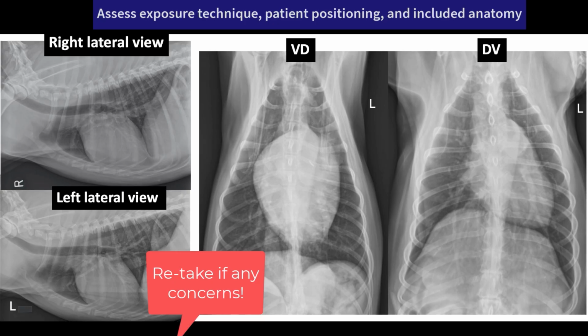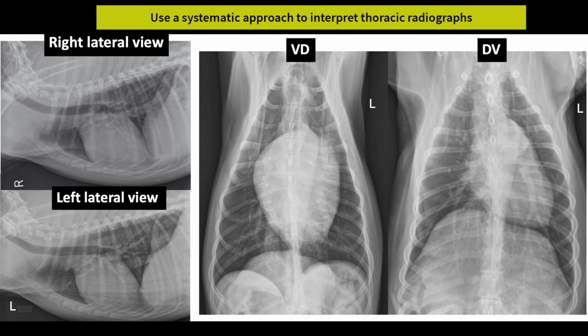This is an example of appropriately exposed and positioned thoracic radiographs. Additional videos and information on evaluation of radiographs for appropriate positioning and radiographic technique, as well as evaluation of thoracic structures, will be provided.